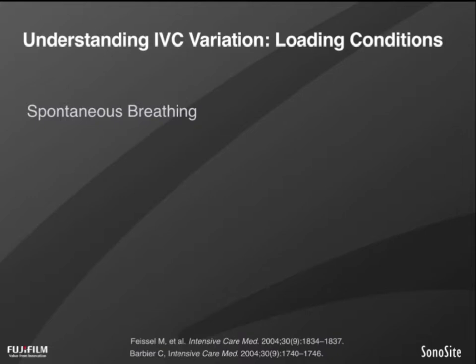Further, patients who are breathing vigorously versus those who are breathing more shallowly will bring about different loading conditions on an IVC. So with that logic, two patients with different breathing tendencies, but who have the same volume status, will bring about different appearances in their IVC, making this test of unclear value for those who are spontaneously breathing.